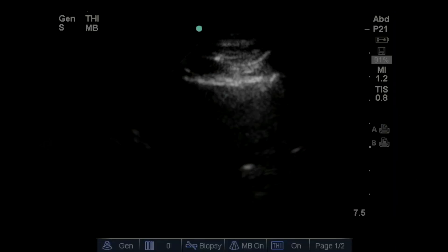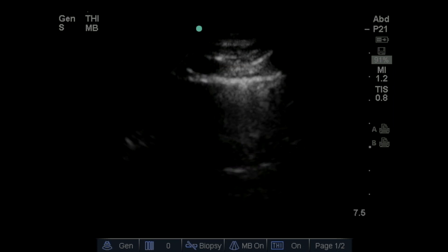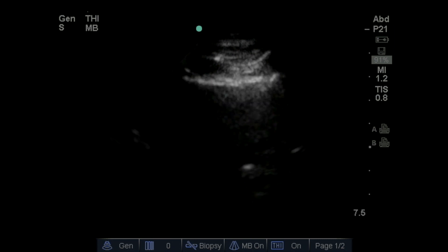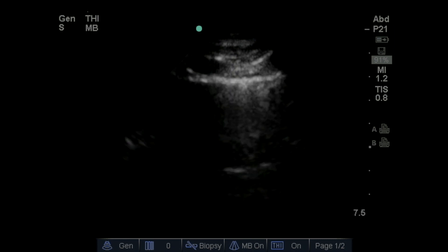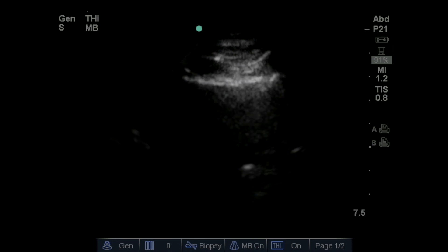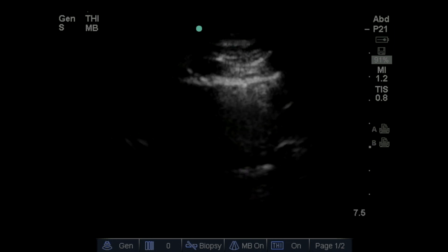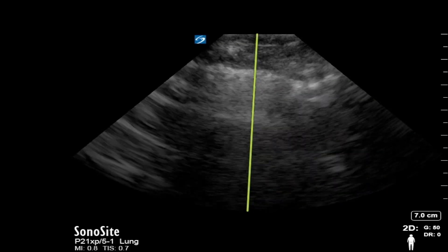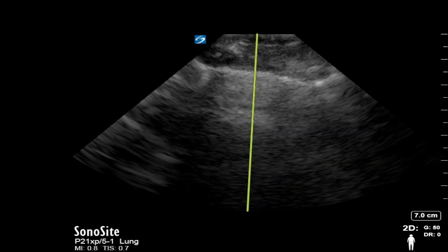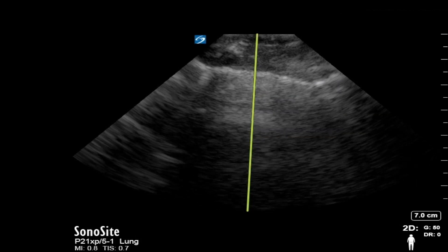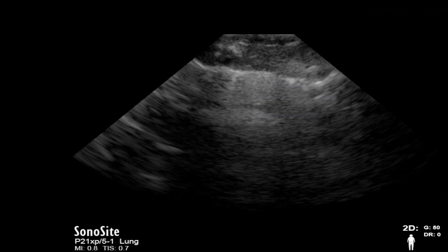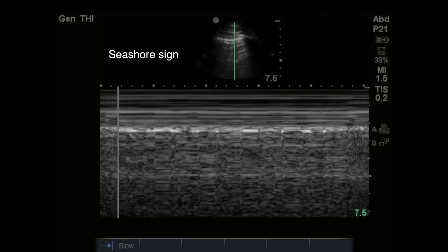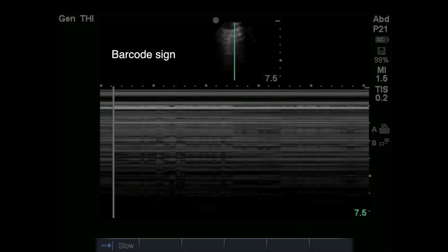Lung sliding is the shimmering effect that denotes the movement of visceral and parietal pleura during respiration. Its presence indicates an intact pleural interface and therefore absence of any pneumothorax in the current field of view. By utilizing M-mode, we can also confirm the presence or absence of lung sliding. We select M-mode and orient the ultrasound beam through the middle of the pleura. The seashore sign is a normal finding suggesting lung sliding is present, while the barcode or stratosphere sign suggests a pneumothorax or absence of lung sliding.